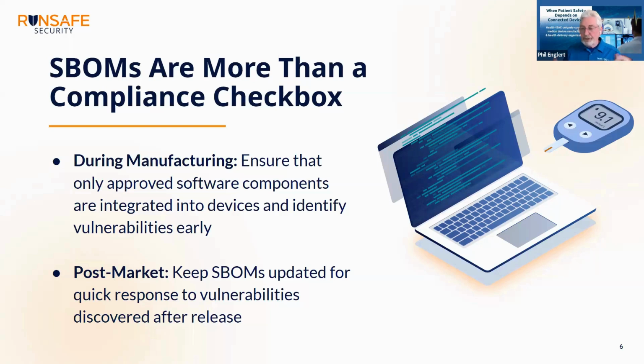But just because those devices have been completely written off the financial books from a capital perspective, they still perform. They still do what they were purchased to do, and there may not be a reason to replace them, except if they run out of support. And it used to be manufacturer end of support, and hospitals would figure out how long they could keep a device running for. And I think that equation needs to be rethought when it comes to vulnerabilities, because just like devices that need more and more maintenance from a physical perspective, they also need more and more maintenance from a component and cybersecurity perspective as well.